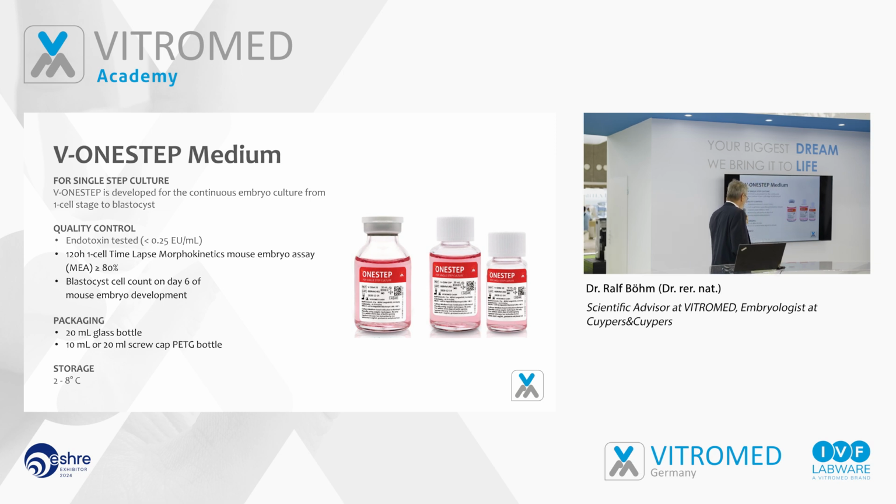That means we do not just control how many, or what the blastocyst forming rate is. We also control by time-lapse the development of the mouse embryos. That gives us a lot of information. And we also do a blastocyst cell count on day 6, because the number of cells in the blastocyst at the end gives some information about the quality.